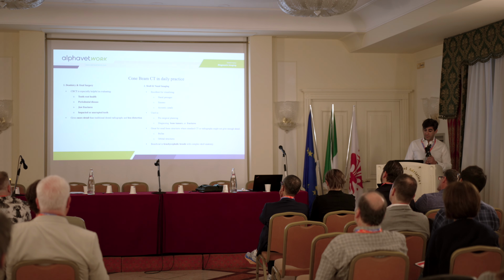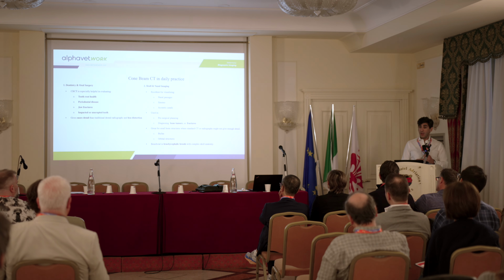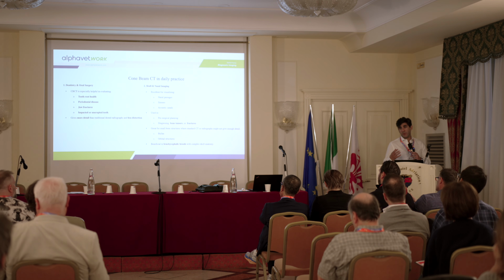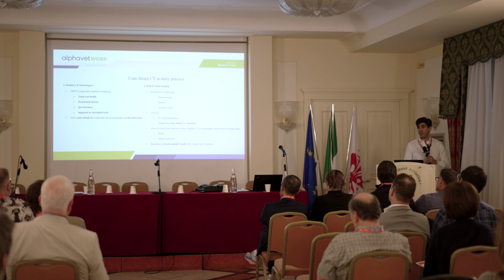We evaluate the tooth root health and periodontal disease, which is very important especially in small breed dogs or feline patients. We can evaluate complex fractures and impacted or unerupted teeth. With the CBCT, we have more detail than traditional dental radiographs and less distortion.